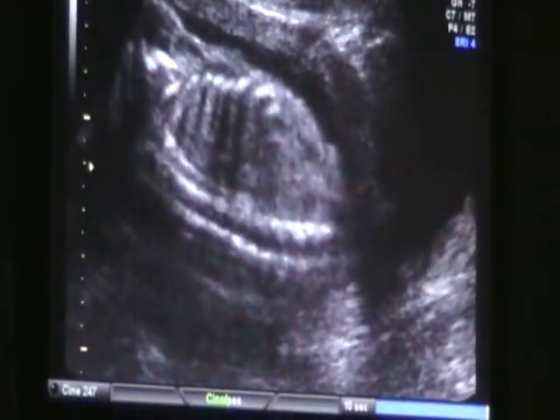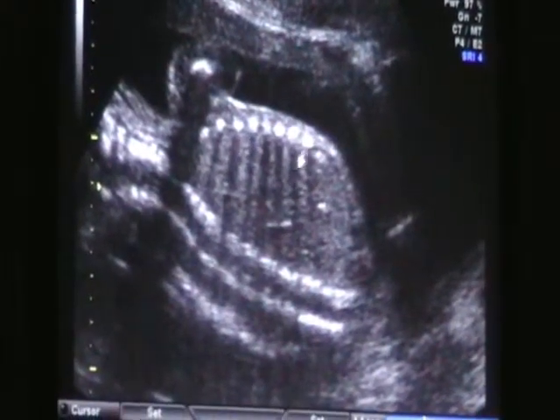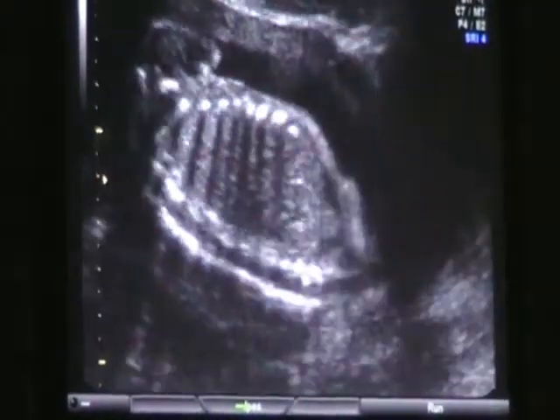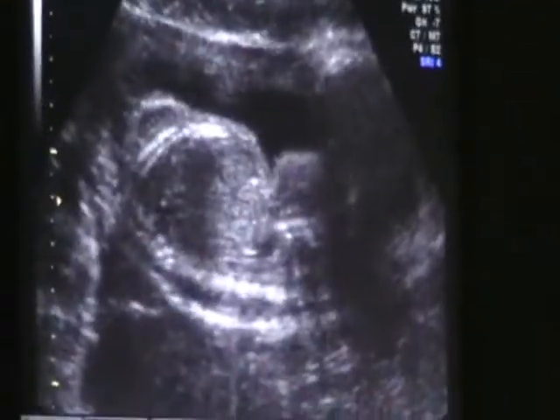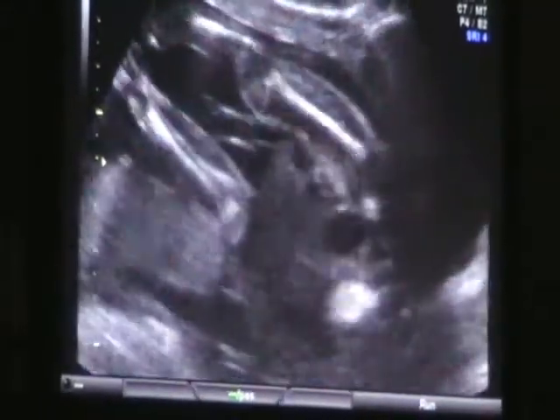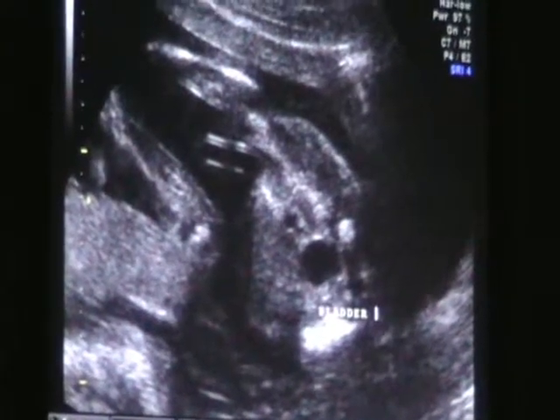That mid-back — you can see that looks very nice. Just like a picket fence, that's what we want to see. Then you can actually see her rib shadows here. She's still cartilage, but the bones are a little more dense than before. There's your urinary bladder right there. So the stomach and the bladder — we're doing good.